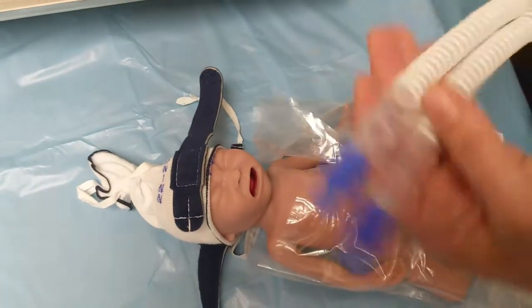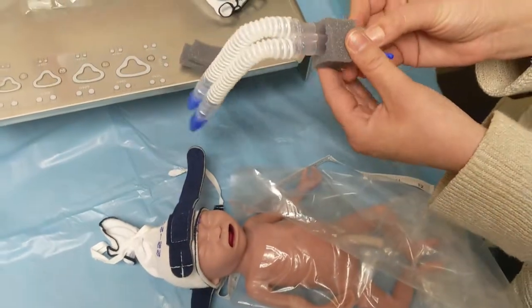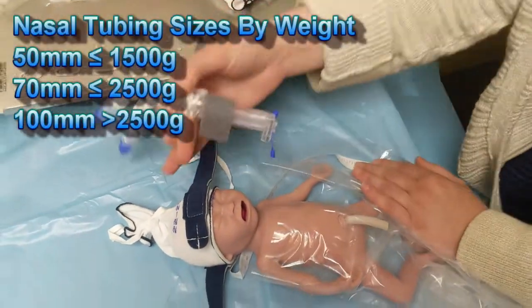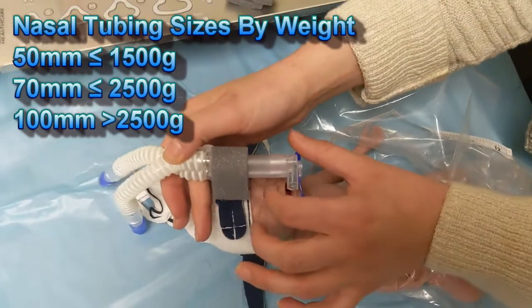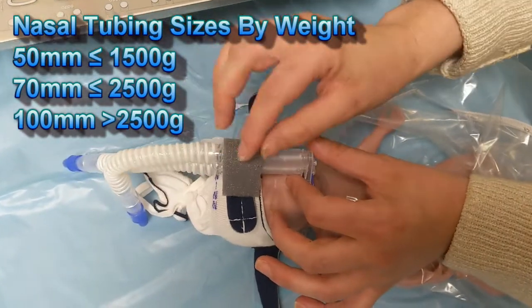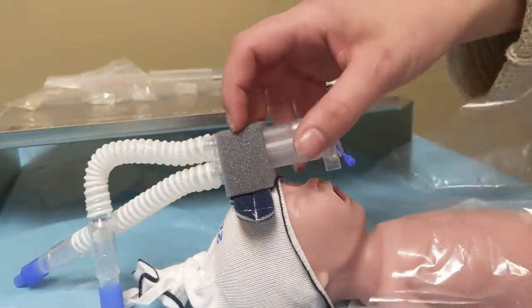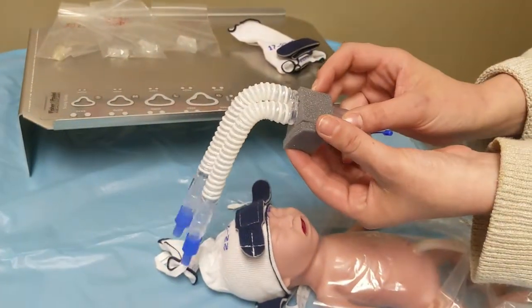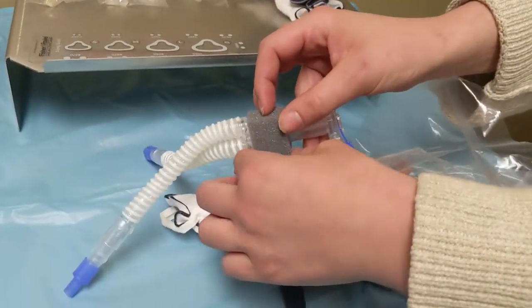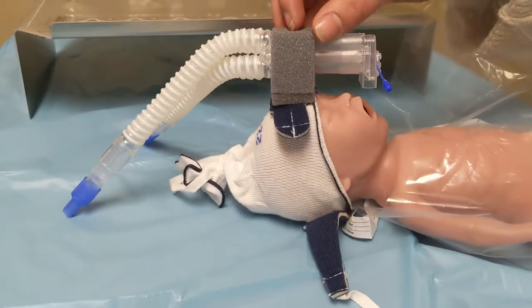Next, we'll pick out our nasal tubing. There are three sizes, and they normally go by weight. This is our smallest size for our smallest baby, and it's the 50. When we're setting it up, we just want to make sure we are parallel with the nose. It looks like we could use one of the additional foam blocks that comes with it. You never want to throw away your foam blocks, just in case you need to adjust. So that looks parallel.